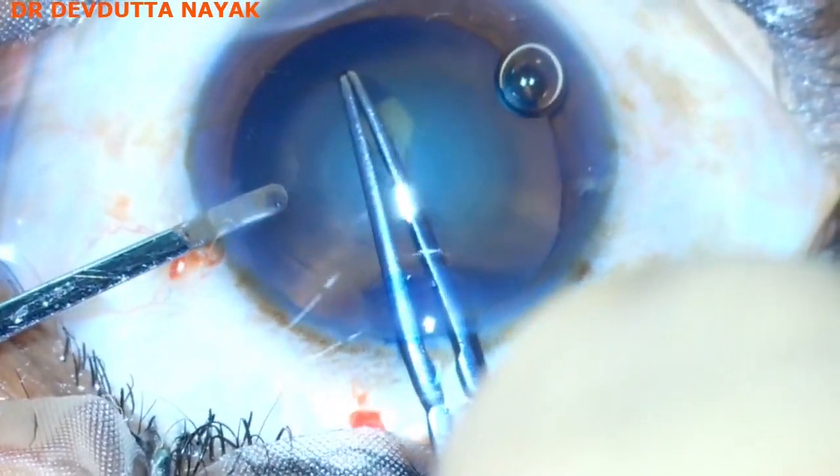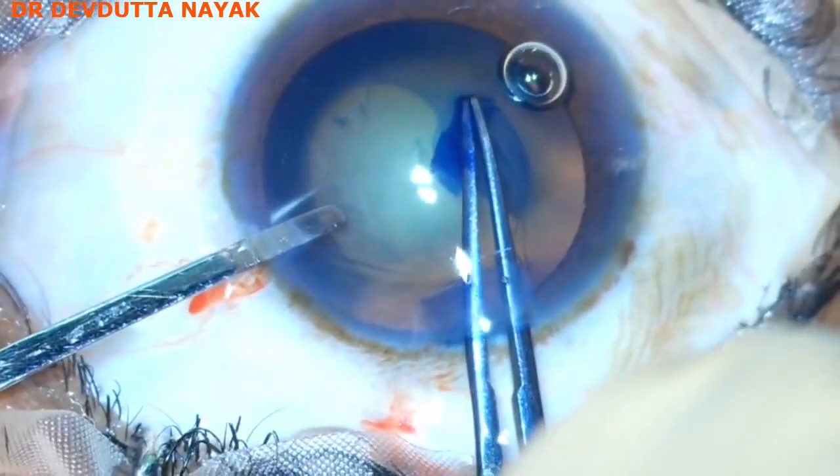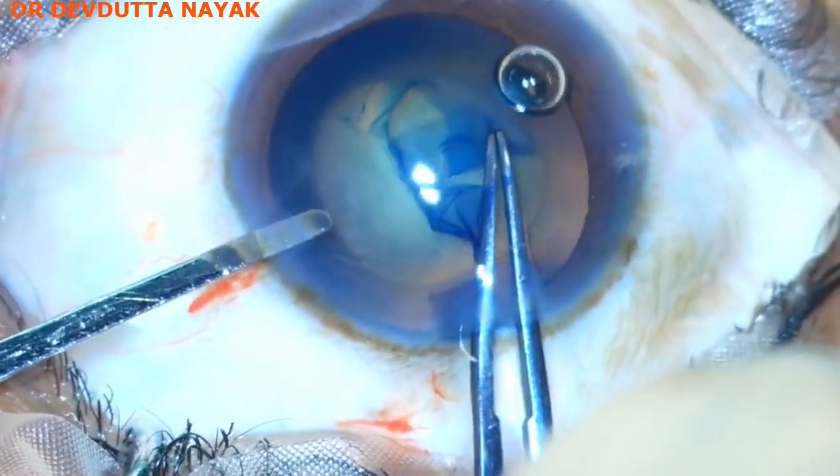A 5.5 millimeter continuous curvilinear capsulorhexis is completed with the help of Utrata forceps.